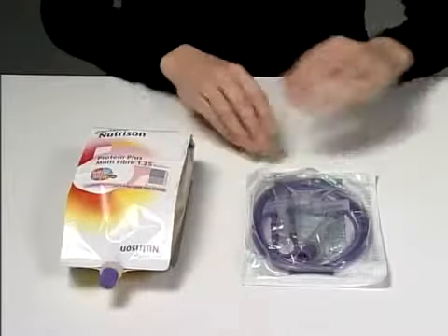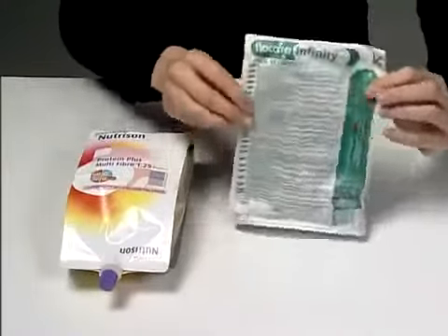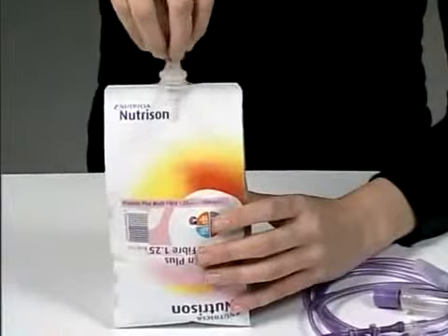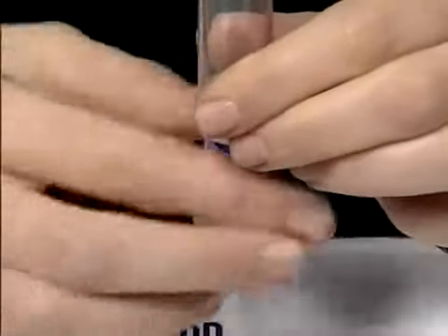First, check you have the correct tube feed and that it's in date. Remove the Flowcare Pack Infinity pump set from its packaging. Unscrew the cap on the hanging pack but leave the foil cover intact. Screw the Flowcare Pack Infinity pump set to the pack.